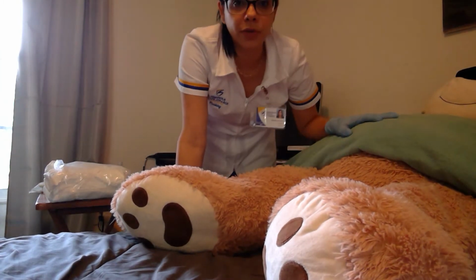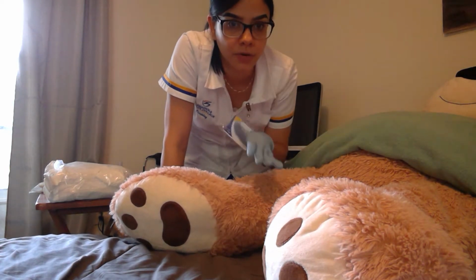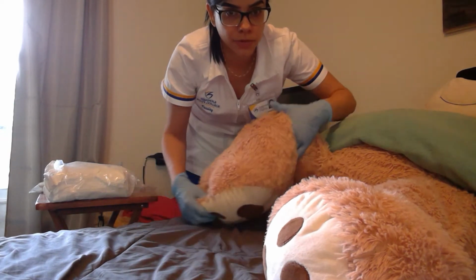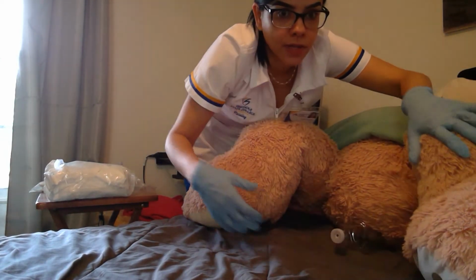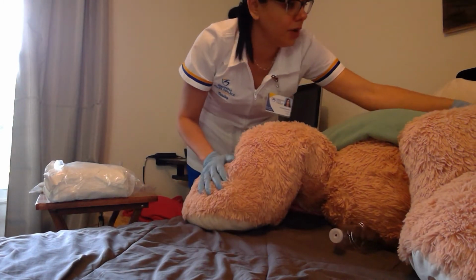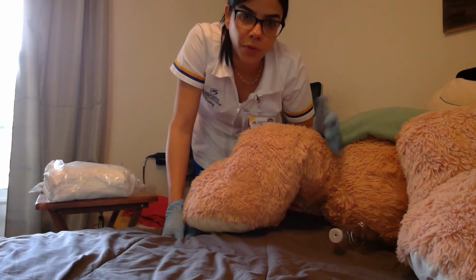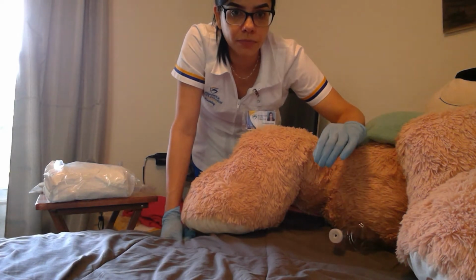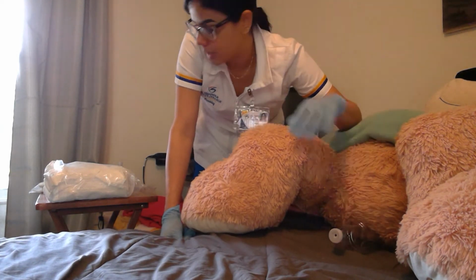Now what we're gonna do is position her in a dorsal recumbent, which is basically having her lying down on her back like this, but we're gonna flex her legs. So legs are gonna be flexed like this, and I am going to expose her vagina. Okay, so before we start, it's sometimes required to clean her before inserting her catheter.